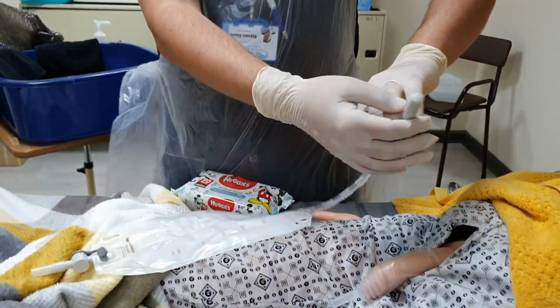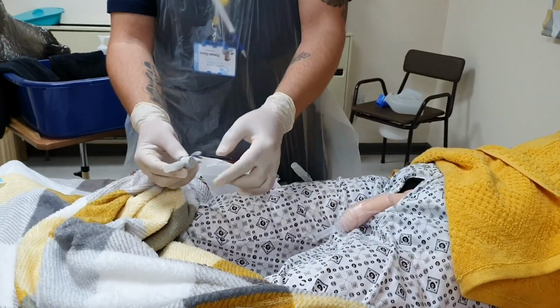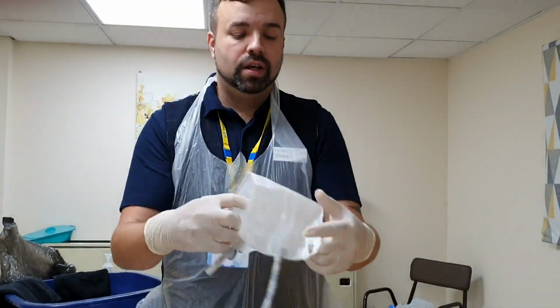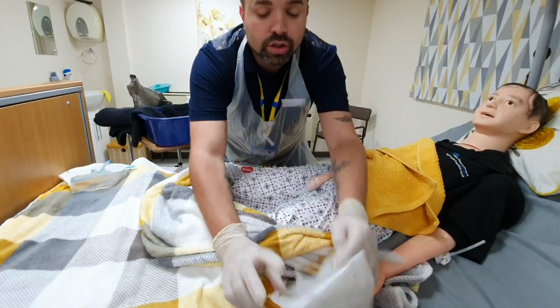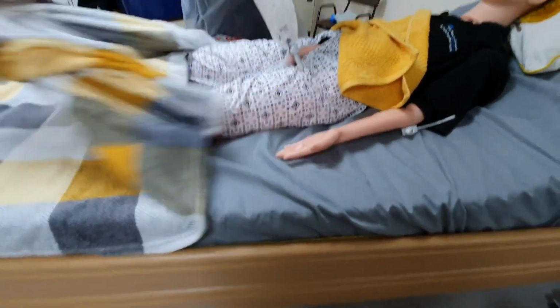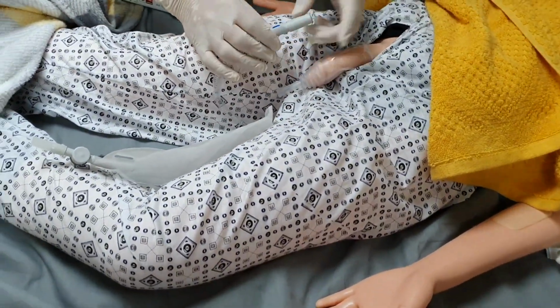you've got your tube with your cover on the top, and you've got the bottom, so where we drain. And you'll see that there's leg straps for here. Okay. Now, if you're laying the patient in bed, there's little hooks that would hook this to the edge of the bed and then the tube would feed in. Or alternatively, you can apply it to the inside of the leg so the tube's not compromised.